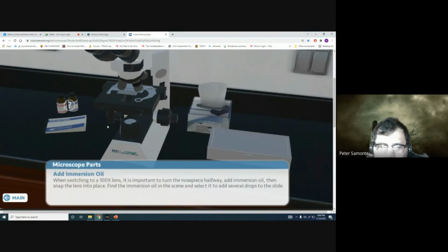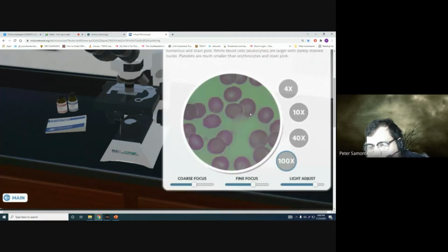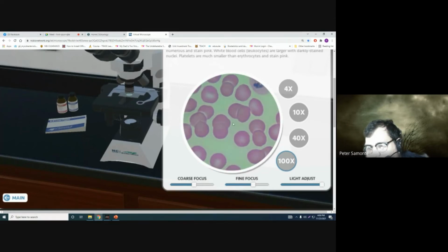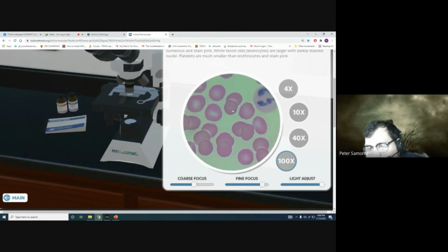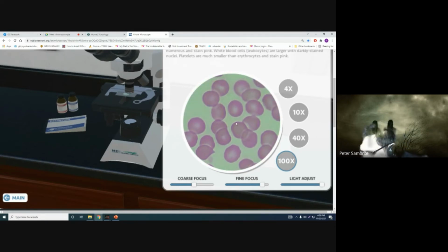Now, with the oil immersion objective, class, you are required to use cedarwood oil. So you put a drop of cedarwood oil on the slide. Then transfer to the oil immersion objective. Then just adjust the fine focus. Now, if you move the coarse adjustment knob while on the OIO, what could happen? What would happen if you suddenly adjust the coarse adjustment knob?